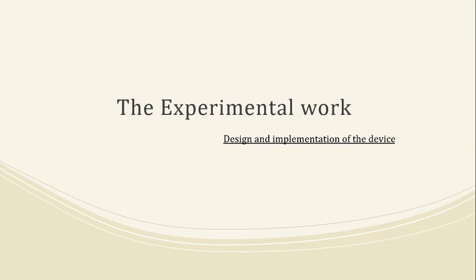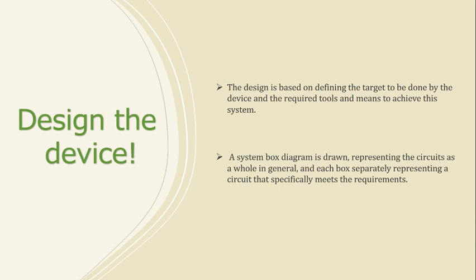After we conducted a detailed theoretical study to reach the goal required of us, which is to design and implement an ultrasound bone density measurement device, an elemental study had to be done on electronic devices to choose the most suitable ones that are compatible with the principle of operation of the device.